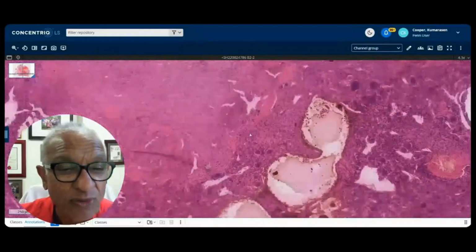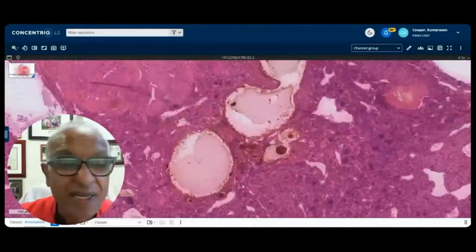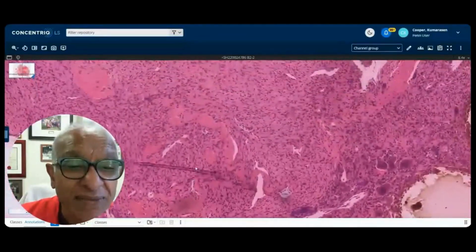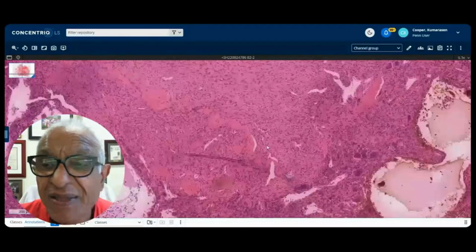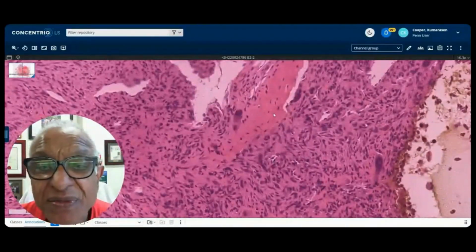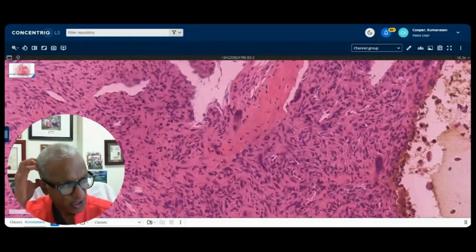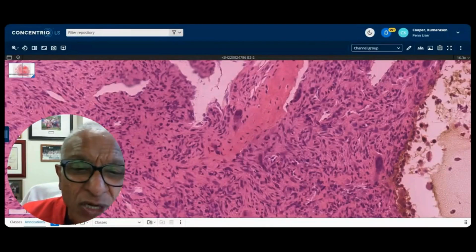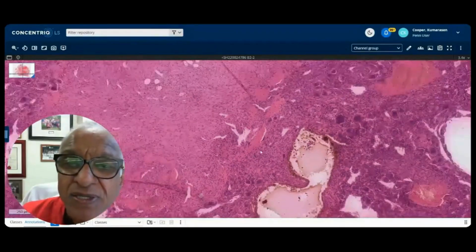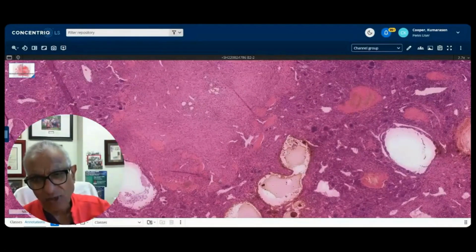There is some bone formation, which I'm looking for whilst I'm talking to you, Ruhani. And there's maybe a little bone here, but even the cells lining these are not... Yeah, there's some bone here as well. They're not ugly, okay? They're pretty uniform, sort of almost like a metaplastic bone formation in these. And you can get bone formation in ABCs. That's not unusual, but you can get microscopic foci of bone as well. So for osteosarcoma, I'd want a combination of radiology and morphology, and for it to look malignant.